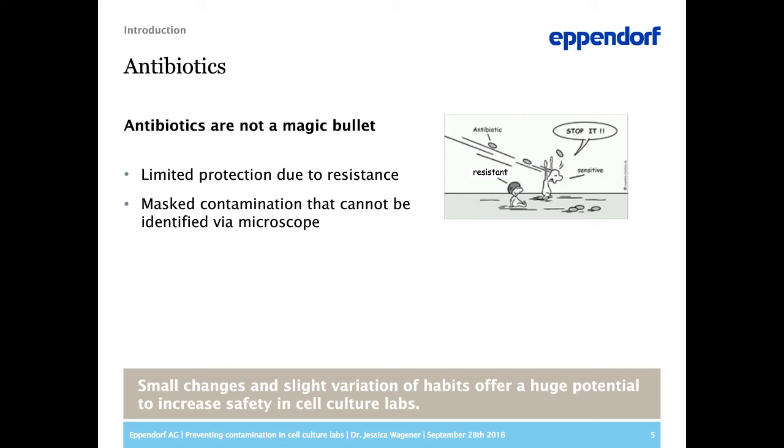Without antibiotics, most of the introduced contaminants would soon be visible under the microscope, or even with the naked eye, as color changes and turbidity of the culture medium occur. The prophylactic routine use of antibiotics in cell culture not only masks poor aseptic techniques, it can also leave low levels of partially resistant contaminants undetected for longer time periods and therefore creating a greater risk for the whole lab.